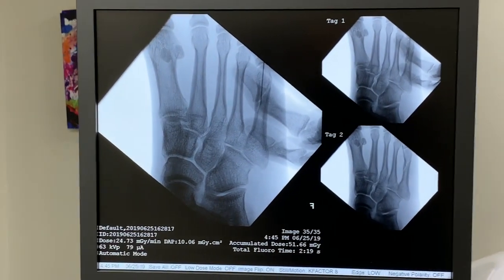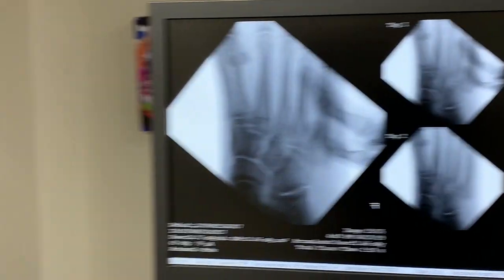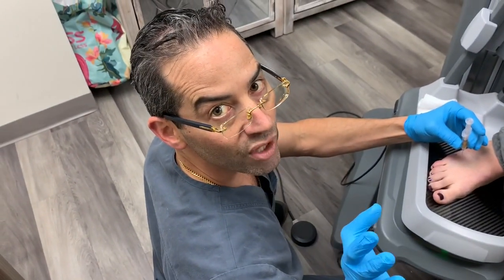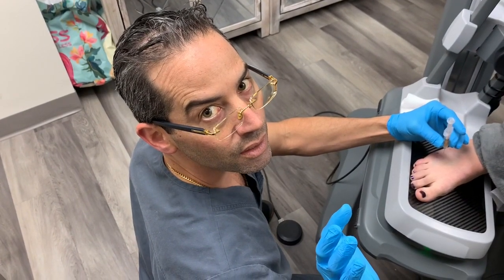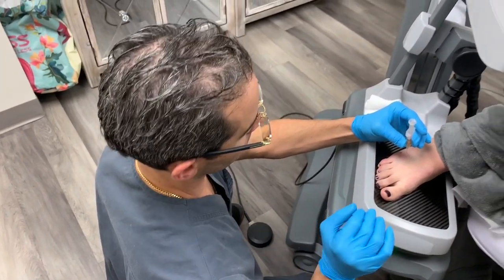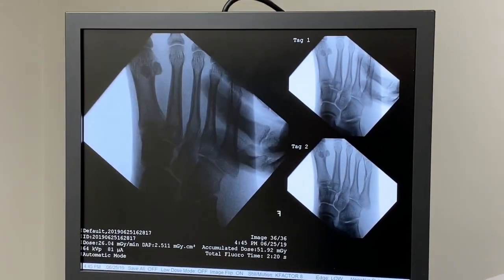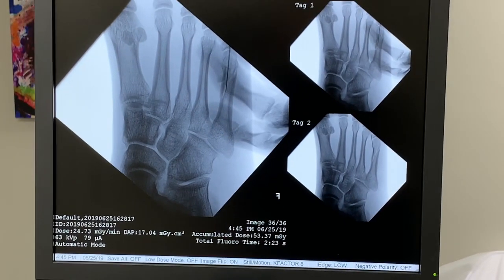Sorry — let me know when it kind of goes away a little bit. For everyone wondering, remember: more volume is not necessarily better. It's about delivering the PRP right where it needs to go. The image looks funny because that's my hand, if anyone is wondering.